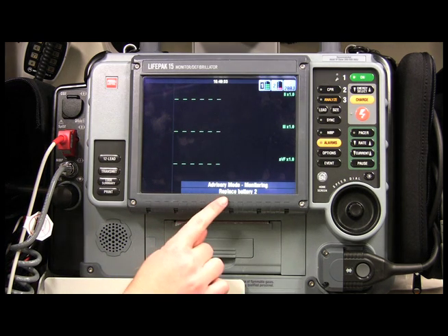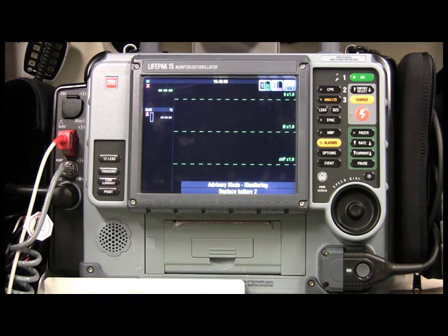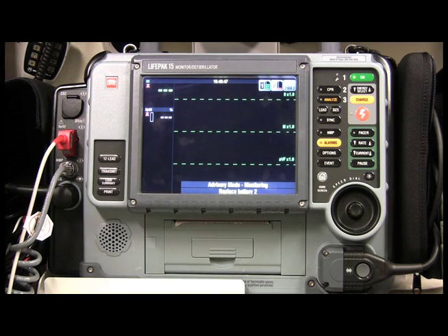You'll notice down below it's telling me to replace battery 2. If you want to check the status of your batteries, look in the top right corner — battery 1 is three-fourths full and battery 2 definitely needs to be changed.